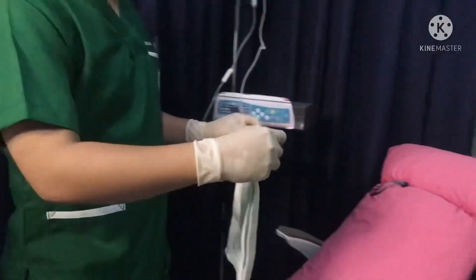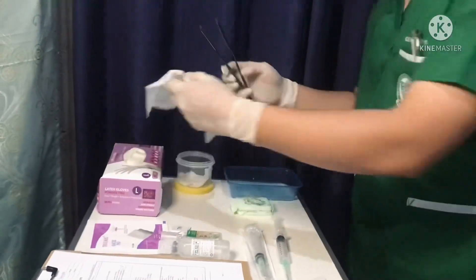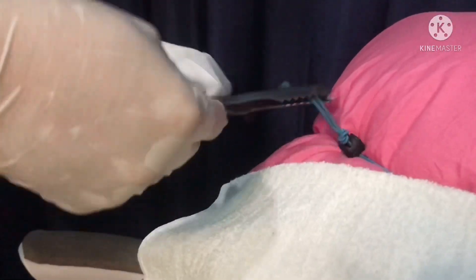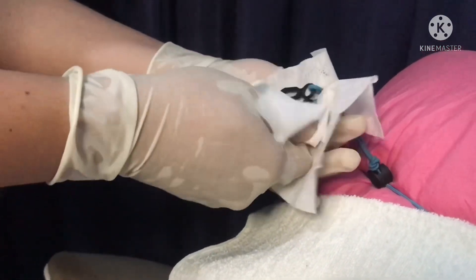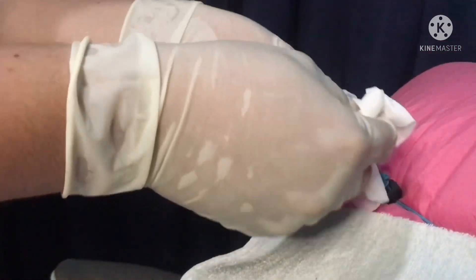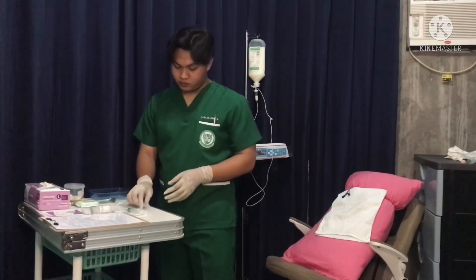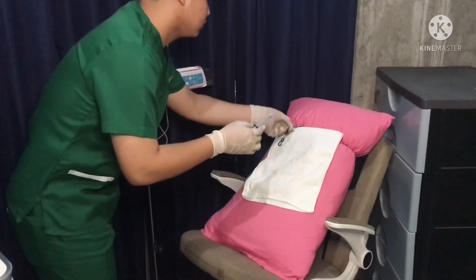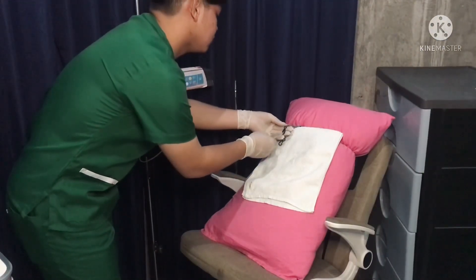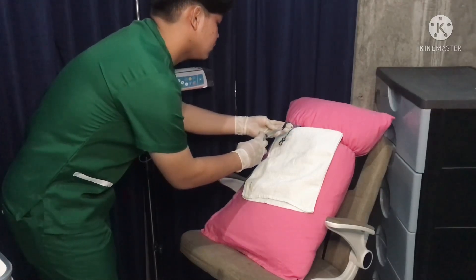Place a sterile drape to the side of the line. Using forceps, pick up the line, holding the line with one alcohol wipe. With a second alcohol wipe, scrub the hub vigorously for 15 seconds, then discard the wipes. Pick up your syringe of saline and attach it to the line. Unclamp the line and draw back on the syringe to ensure you see a flash of blood. Using the push-hold technique, flush the line.